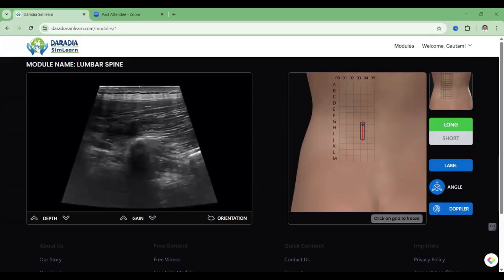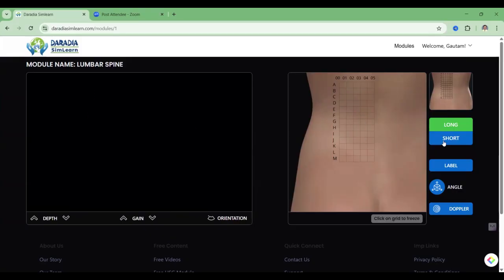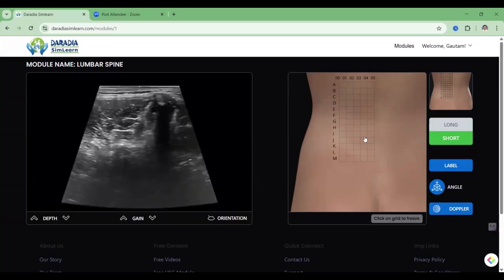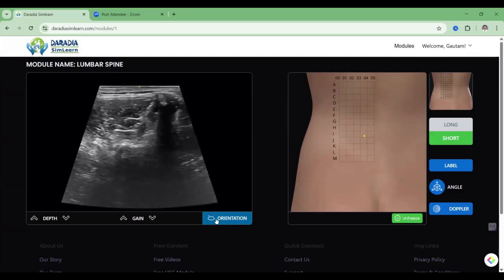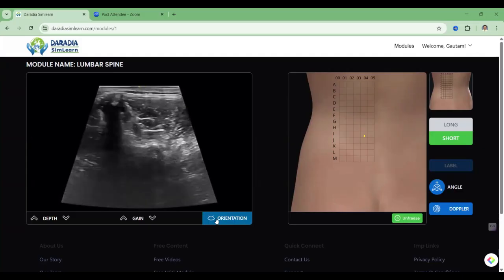Suppose you want to see it in the short axis — click on short. If you want to study some of the image, you just click it and it is frozen. You can see this frozen image on the left hand side. Here you can change the orientation, just like the ultrasound probe has an aspect marker. By clicking it, the orientation is changed.